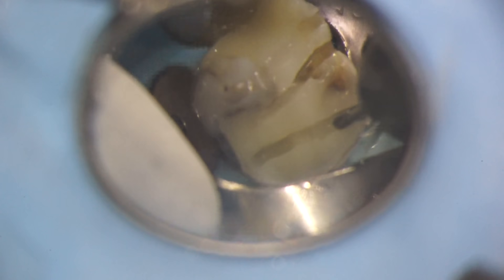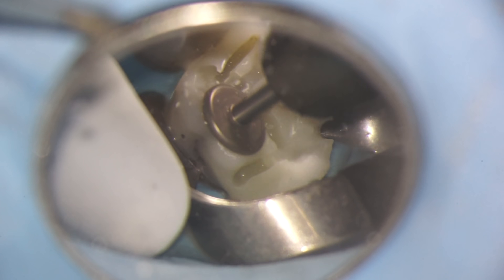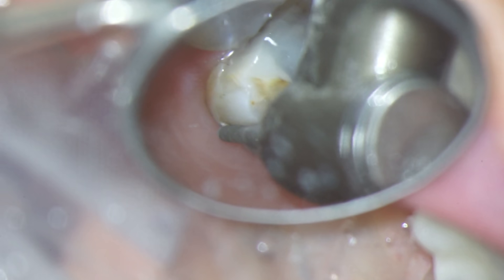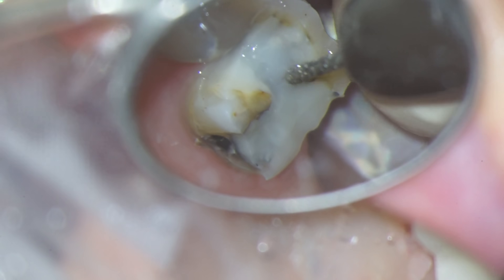I have another video that shows this in much more detail, so if you'd like to see that here's the link. Essentially the whole point of a crown is to create a porcelain shield that goes all the way around the tooth to protect it from fracturing.